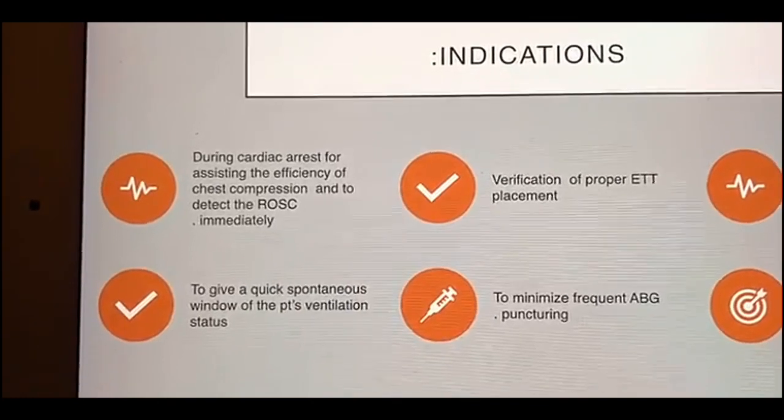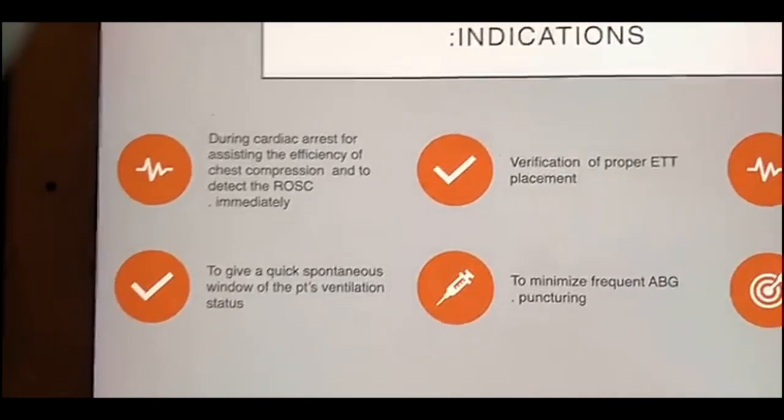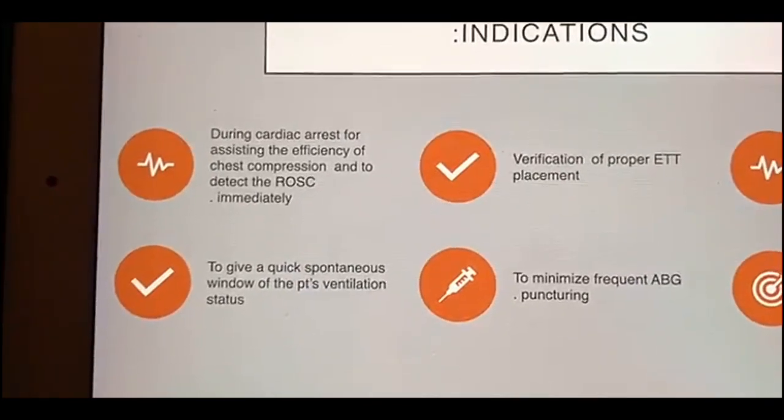And regarding the return of spontaneous circulation, it will detect it immediately by showing a high peak in the waveform.